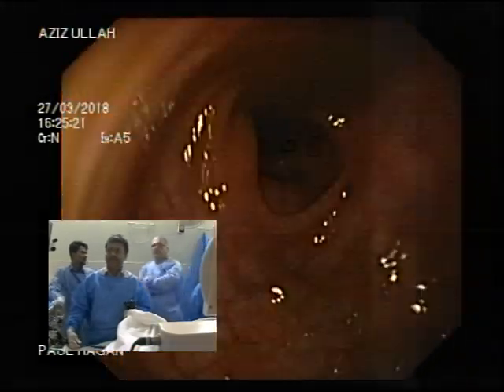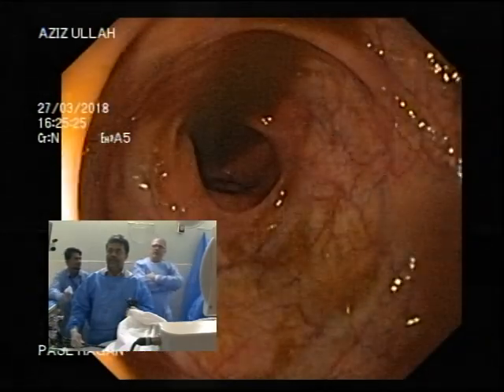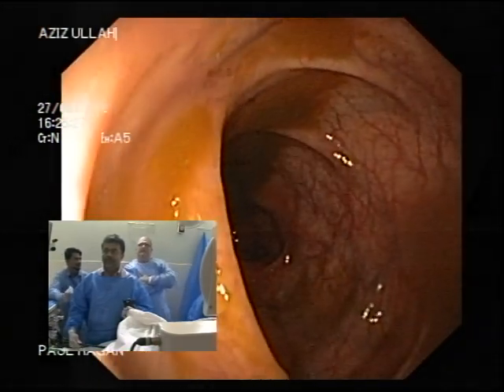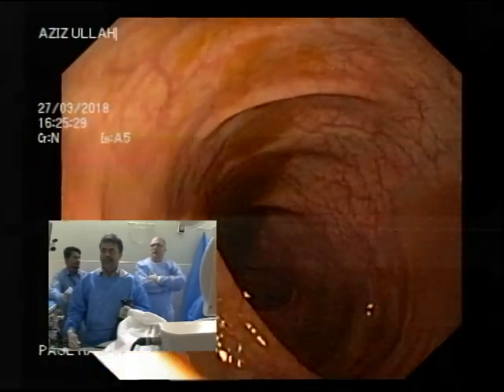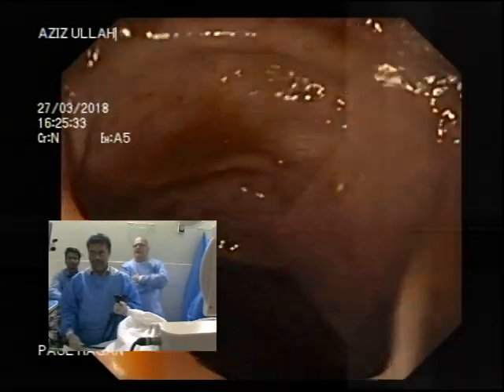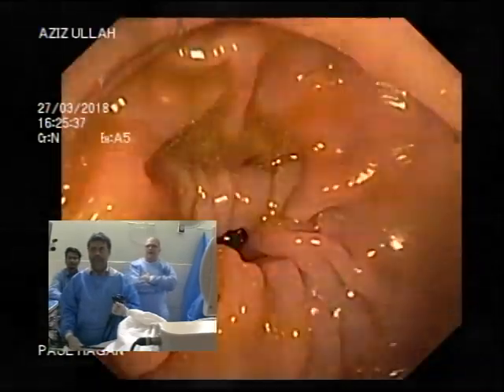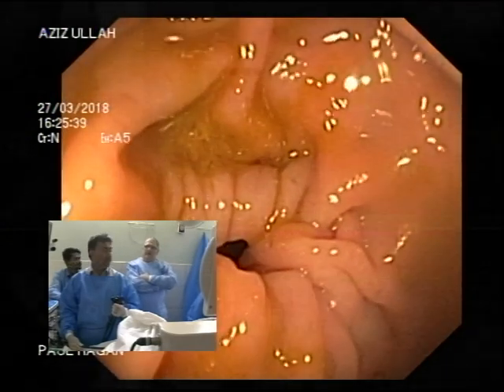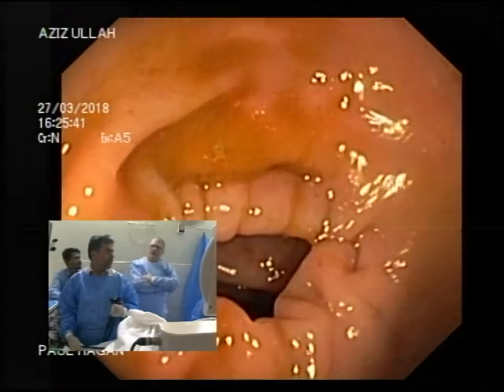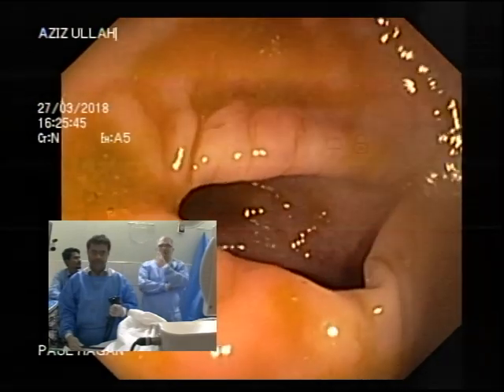Keep coming. We want to get to where the aphthous ulcers are. Let's have a look at them now. Now we've got a bit of air in. Now they could be down to the bowel prep. That's the most important thing. The last thing we want to do, so I just let Eric know that we consider taking biopsies, but the last thing I want to do is take biopsies from an area where we might put aphthous ulcers, and it gets people all alarmed. Is it bowel prep related?